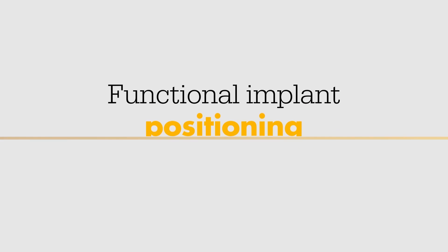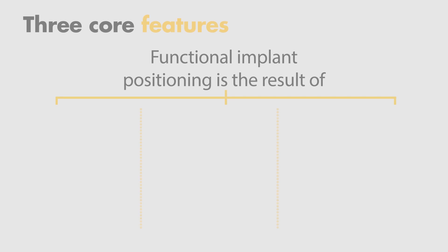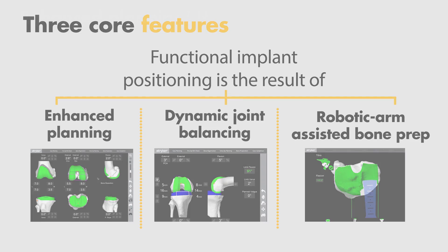MAKO is designed to achieve functional implant positioning, which is patient-specific implant placement as a result of enhanced planning, dynamic joint balancing, and robotic arm assisted bone preparation. These three core features were adapted to enable a MAKO total knee procedure with Triathlon.